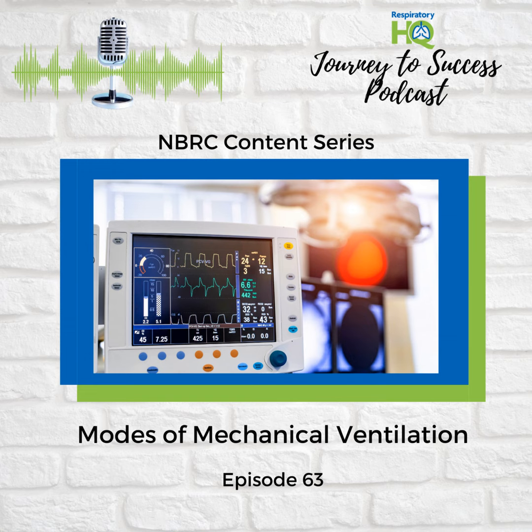But even with that assistance, I imagine there's still a delicate balance to strike. You're right. One of the potential downsides of ACV is the risk of hyperventilation, especially in patients who have a central nervous system injury. They might trigger the ventilator too often. This can lead to a decrease in carbon dioxide levels in the blood. So it's like they're getting too much of a good thing, the ventilator's helping, but they're maybe overdoing it a bit. Precisely. And this highlights the importance of close monitoring with all of these modes.